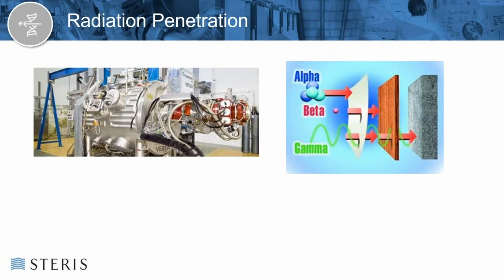Another type of radiation is the beta particle. We call them betas when they come off of radioactive isotopes. They are electrons. They have a negative charge. We wouldn't typically use that term beta to describe a machine source electron radiation, but you could. I've heard the term beta beam. As you can see, that beta particle travels through your paper, but is blocked by something a bit more substantial, like a big chunk of wood.